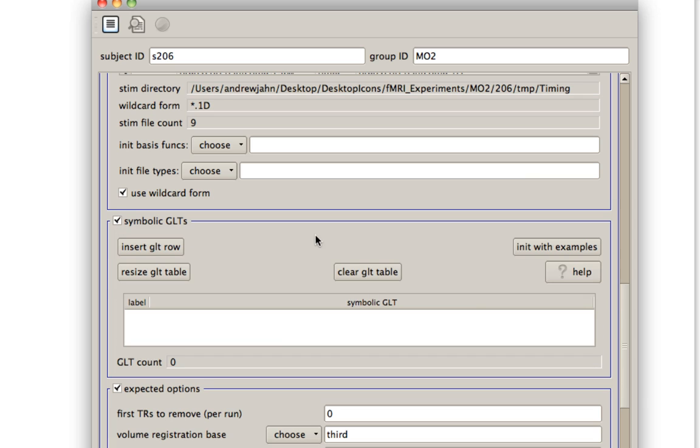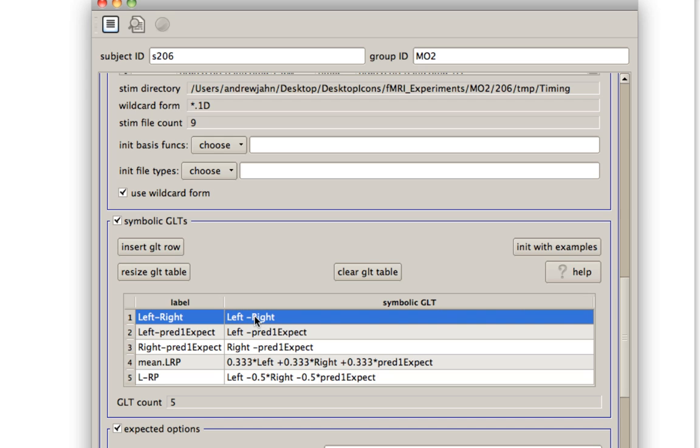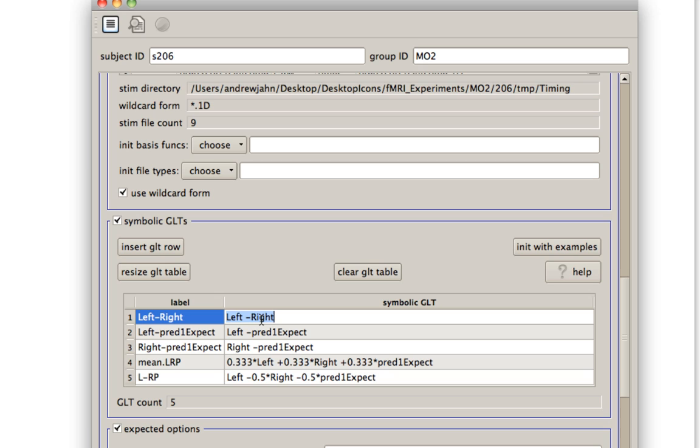For symbolic GLTs, these are any contrasts that you want to carry out with your dataset. Usually, it's helpful to use this init with examples, which will initialize this with some example contrasts that you can use. You can go ahead and from here, you can alter these. So let's say instead of left minus right, I wanted right minus left.